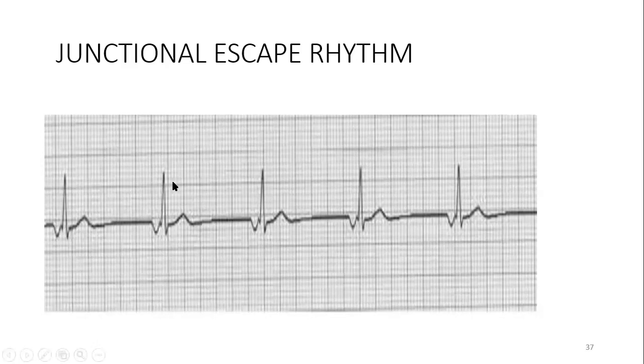And when you count the heart rate in this ECG, you also realize that the heart rate is less than 60 beats per minute.